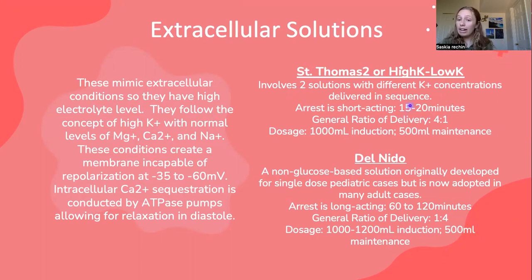It has shorter acting arrest time, so 15 to 20 minutes when they need a new delivery. It's delivered 4 to 1. Your normal induction dose is about 1 liter, and your maintenance is about 500 generally.